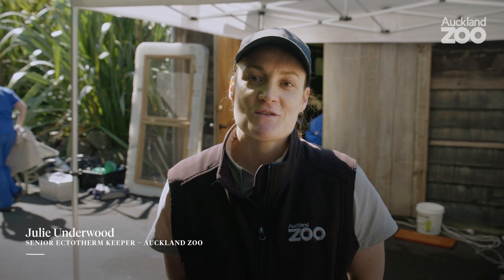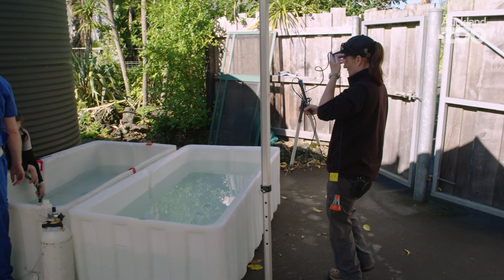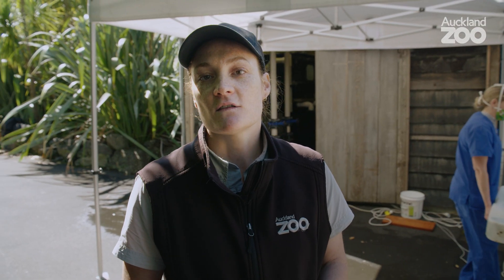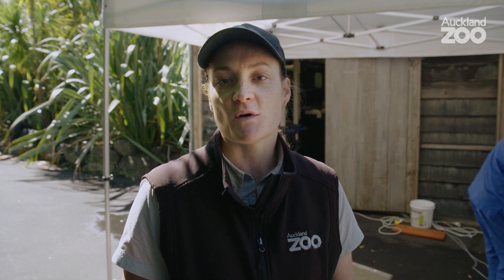My name is Julie and I'm one of the ectotherm keepers here at Auckland Zoo. Today we're x-raying one of our longfin eels, or tuna as it's known in Māori. It's got a small bend in its back, so we're going to x-ray and ultrasound to see what's going on.